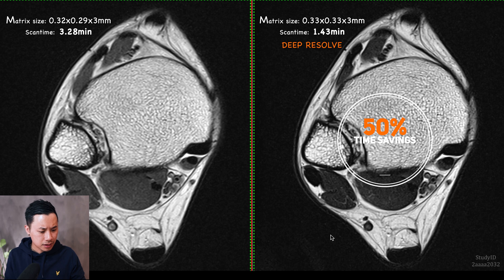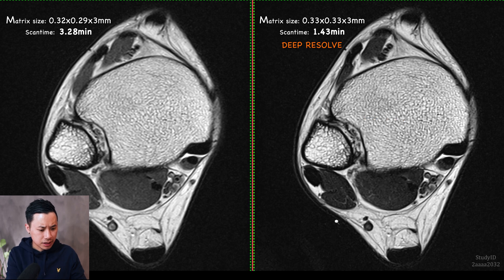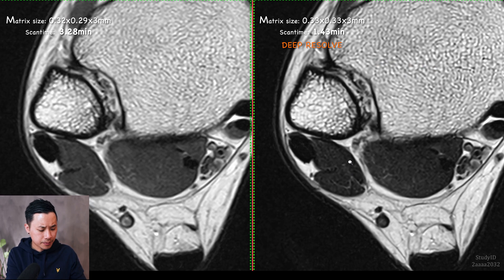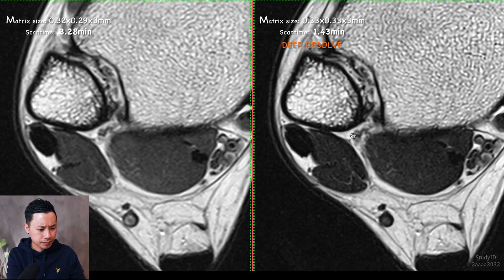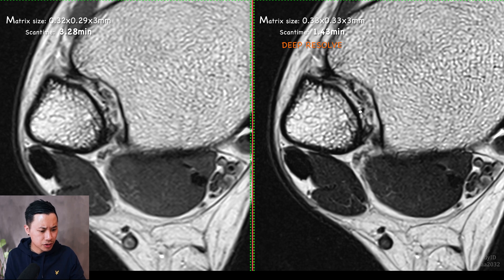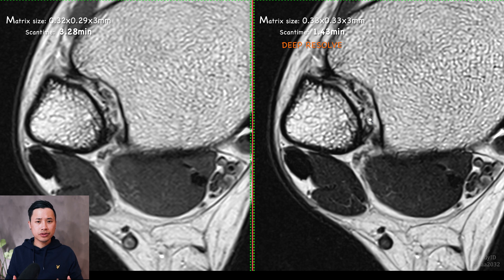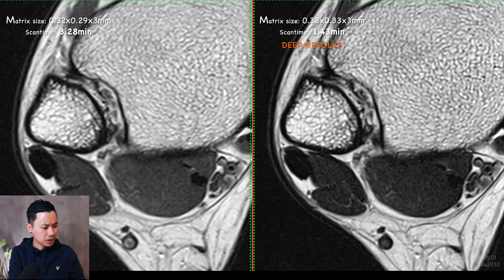Let's check these images. You can see the small structures right here — they seem a little bit sharper, even though you have a lower resolution. That's what you get when you save a lot of scan time.